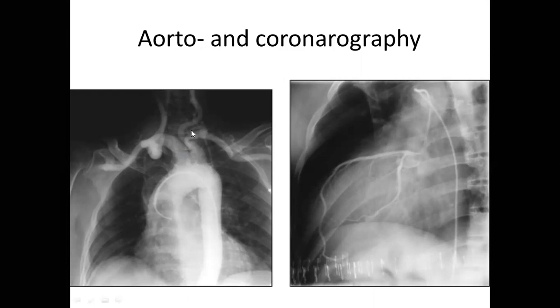Here is the left common carotid artery, and this is the subclavian. On the right image, you are able to see how we administer contrast exactly into the coronary arteries, which is also very informative if patients have coronary artery disease.